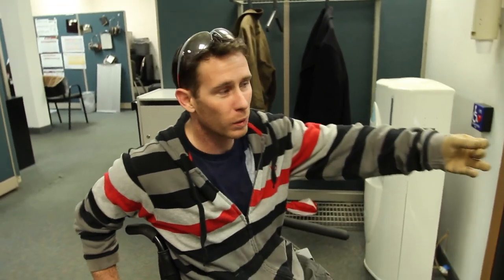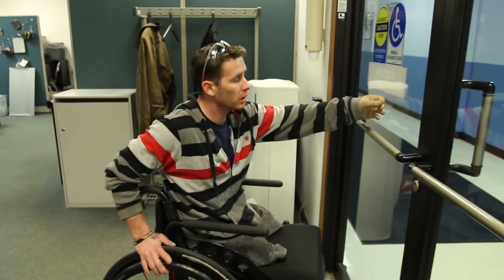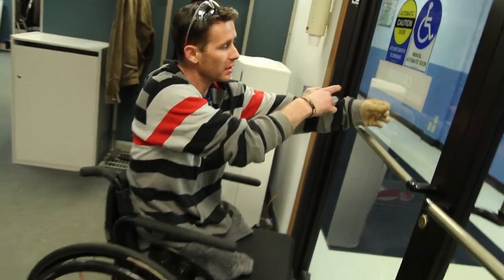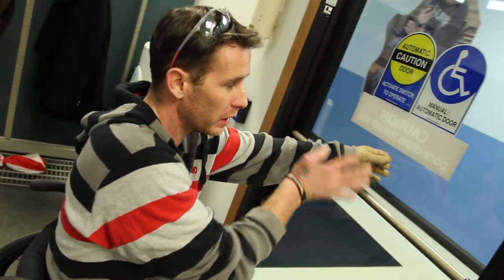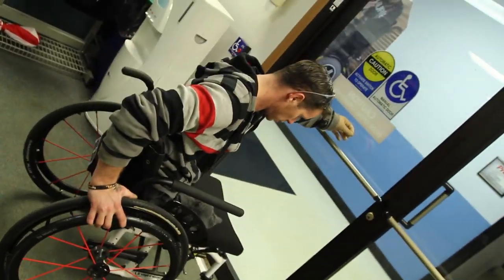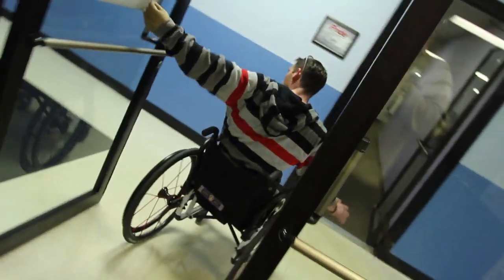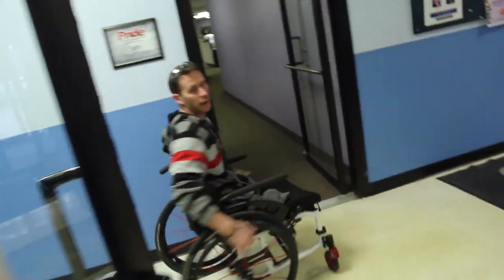Going out the door with a regular push door, you put one hand on the door and the other hand pushes through. Pushing on the door will balance out your stroke so that you go straight through the door. Put your hand on, push through, and that's it.